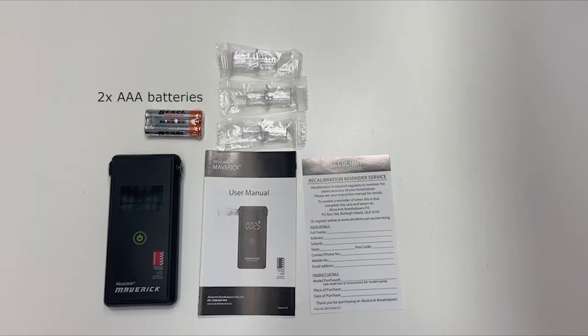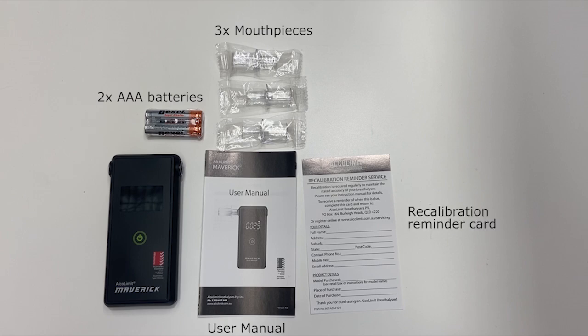The Maverick comes with two AAA batteries, three standard mouthpieces, a recalibration reminder service card, and a user manual.